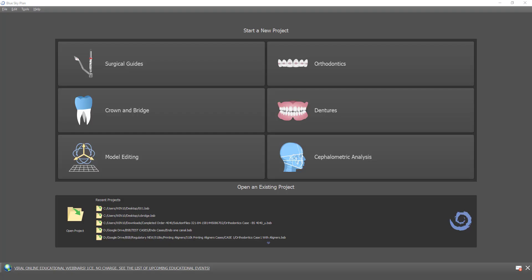We are going to quickly work through the process of a digital tooth setup to show the end-to-end process flow. If you're familiar with doing a digital tooth setup in BlueSky Plan Ortho, then you can skip ahead to the point where we describe the process of creating the aligner trim curve and generating the machine code.